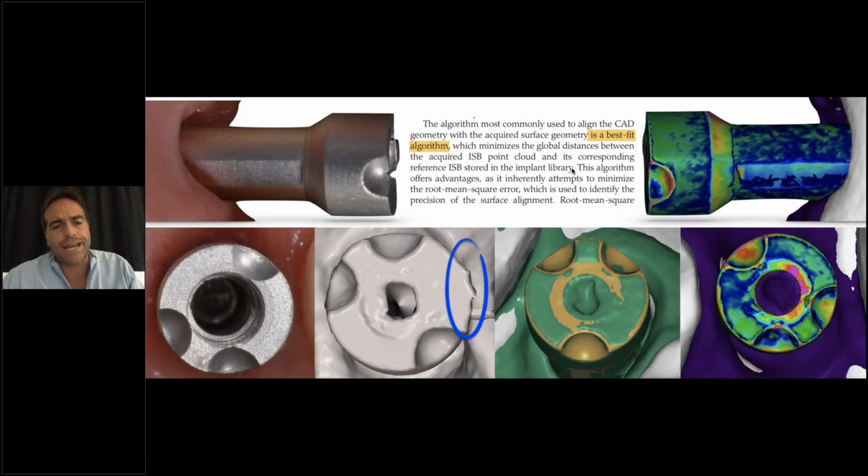So you see that scan bodies, once again, here we have another image, are extremely important, but also the knowledge of the scan body during the best fit is important. Here you see another shape of a scan body in which there is a scan noise. You can see here inside this blue circle. It's in an area that we don't care about, like also the hole we don't care about. So if there is a scan noise in that area, the lab technician can simply cut it and then do the best fit and move forward with the workflow.